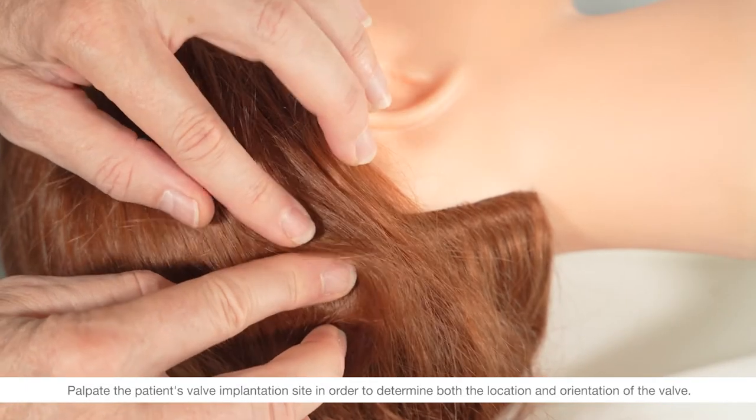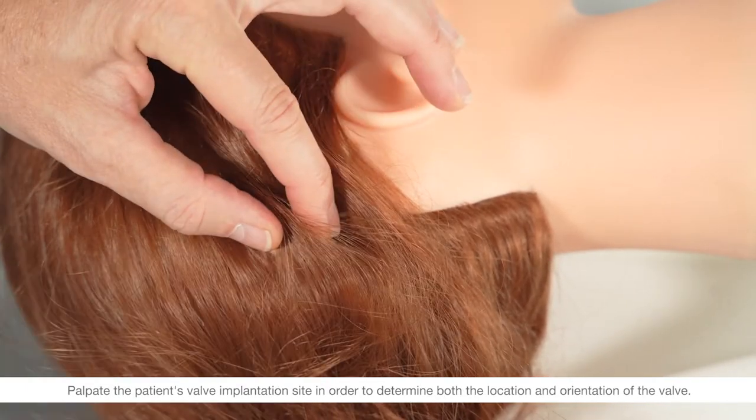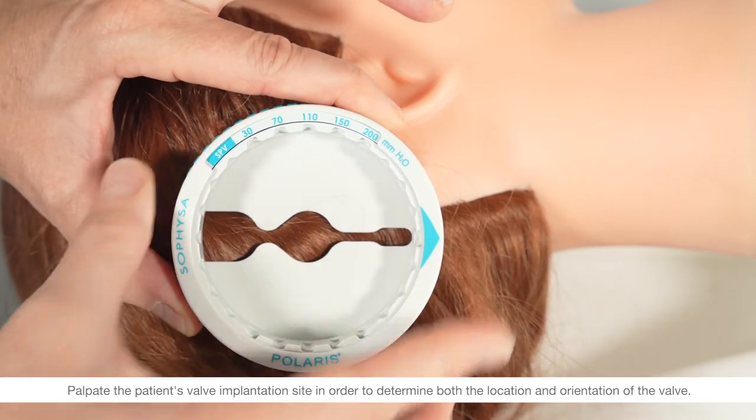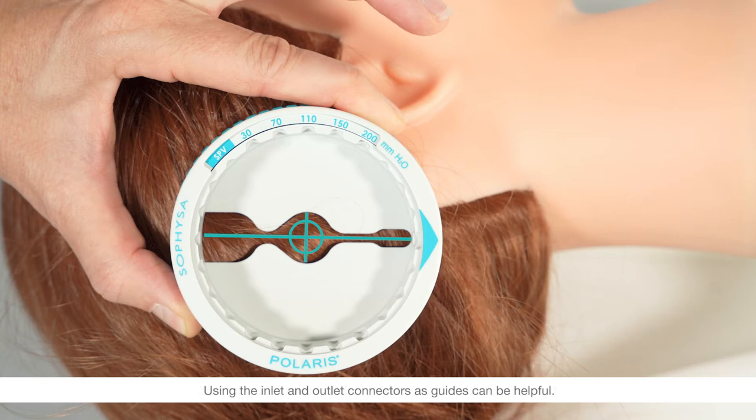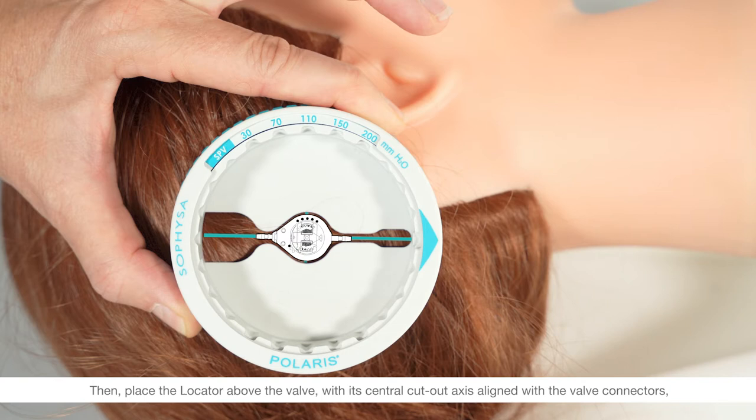Palpate the patient's valve implantation site in order to determine both the location and orientation of the valve. Using the inlet and outlet connectors as guides can be helpful. Then place the locator above the valve with its central cutout axis aligned with the valve connectors and with the arrow of the locator pointing in the direction of the CSF flow.